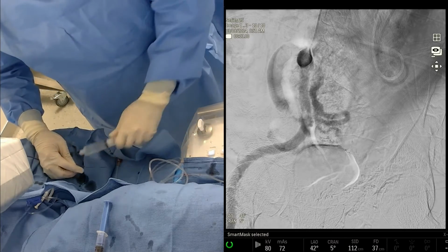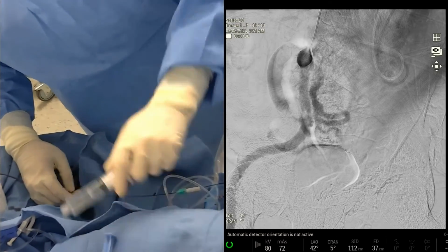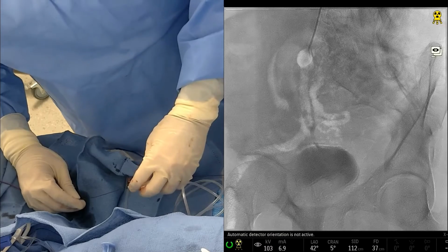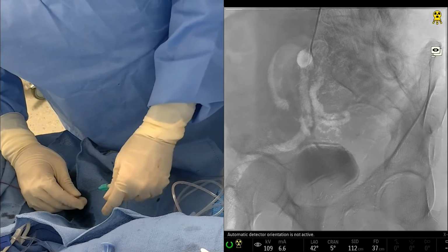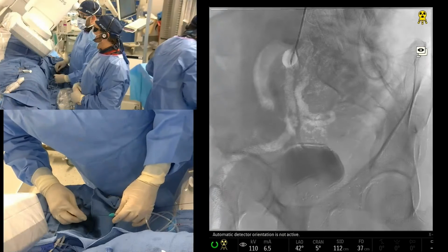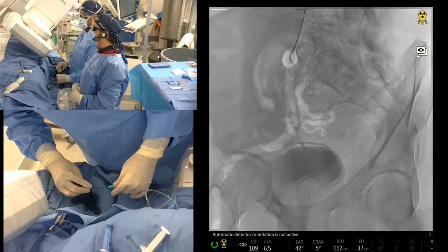Well, I mean, even just looking at that glue cast, looking at that embolization, that's quite a vessel to recanalize that entire way. Right? We're not dropping a small glue plug. We're not just going distally with a few millimeters. There are so many studies that have looked at the effect of glue on the artery, and it really creates a fair amount of vascular endothelial damage and inflammation, and so we want to use that to our advantage. That's one of the best properties about glue, in my view. You want something that can do that.